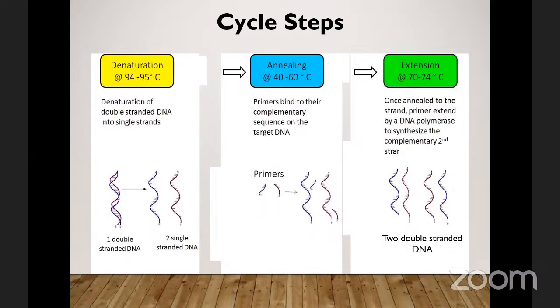were designed for, and they will go and attach to that target if the virus is actually in that sample that you added. But if the virus is not there, the primers will only float freely in the reagent. There will be nothing for them to attach. I want us to get this part very, very well. If the virus or the target, what you want to diagnose, is not present, the primers will only float. There will be nowhere for them to anneal or attach to.